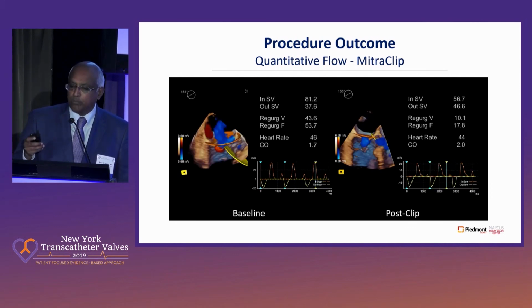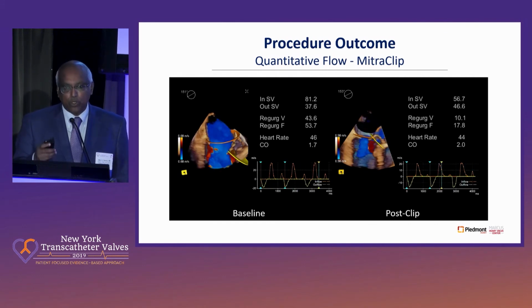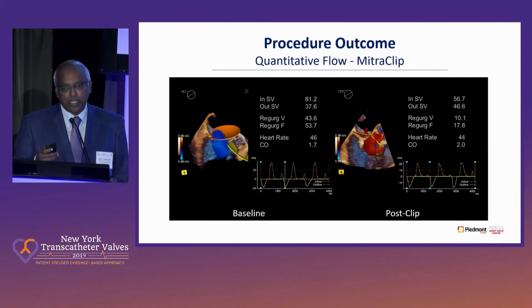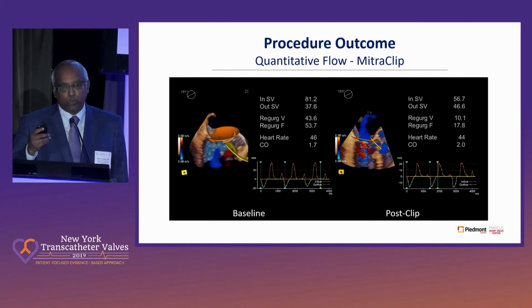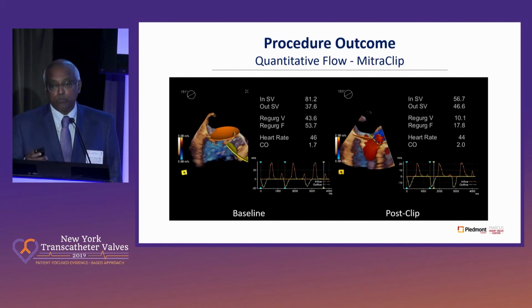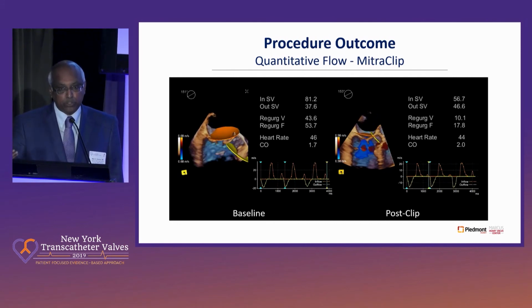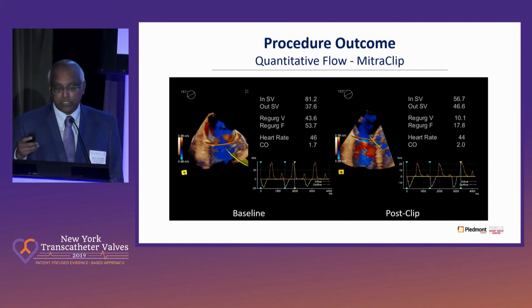I haven't talked about fusion imaging. I don't know if it's a serious contender or it is just a pretender in the cath lab. Our experience has been it more gets in the way of doing the procedure than actually helping the procedure. But keep your mind open. It may still be useful, perhaps on the mitral side or on the tricuspid side.